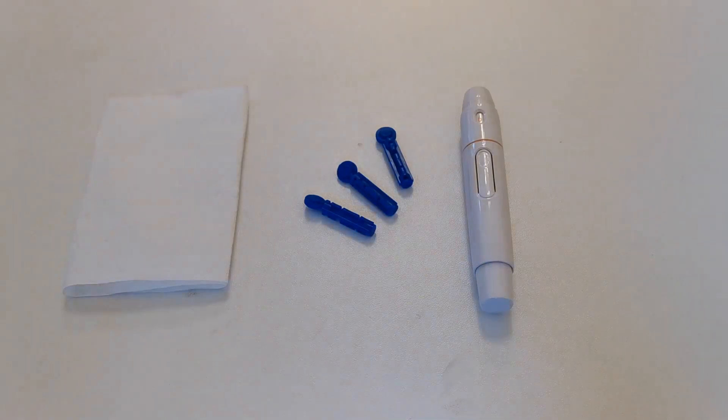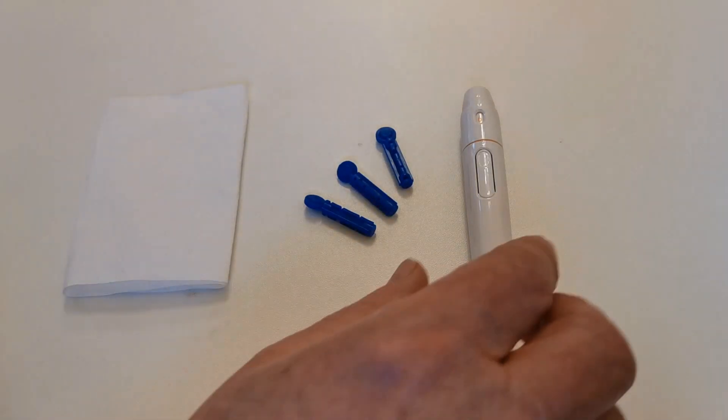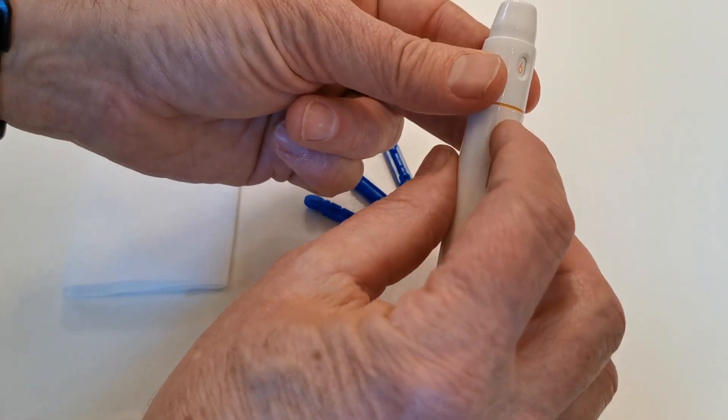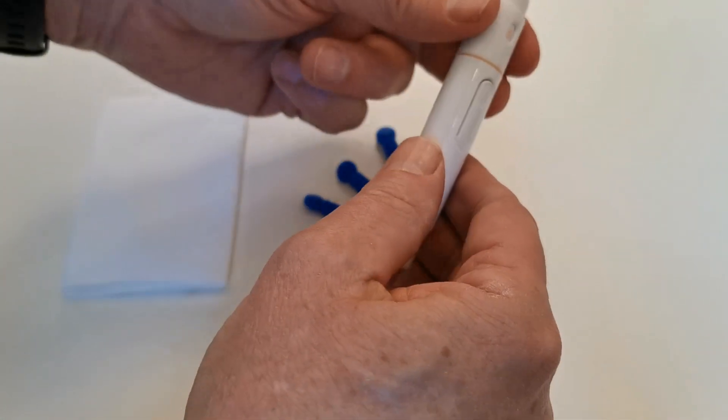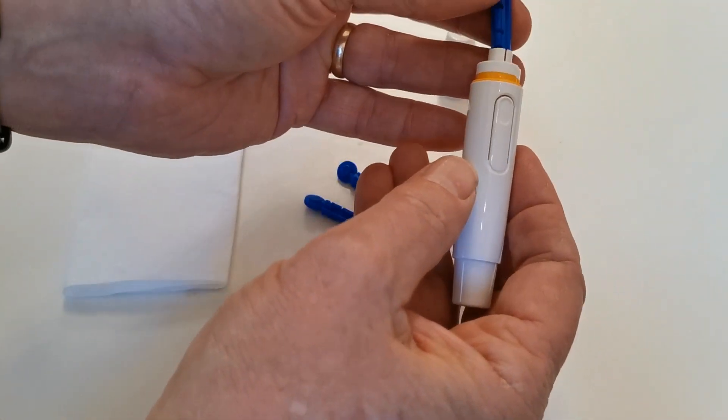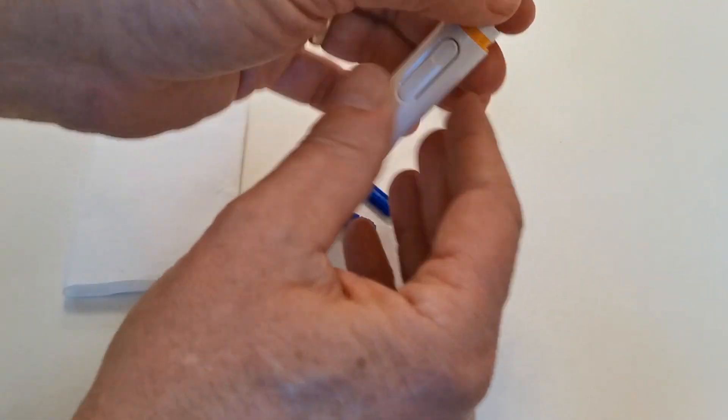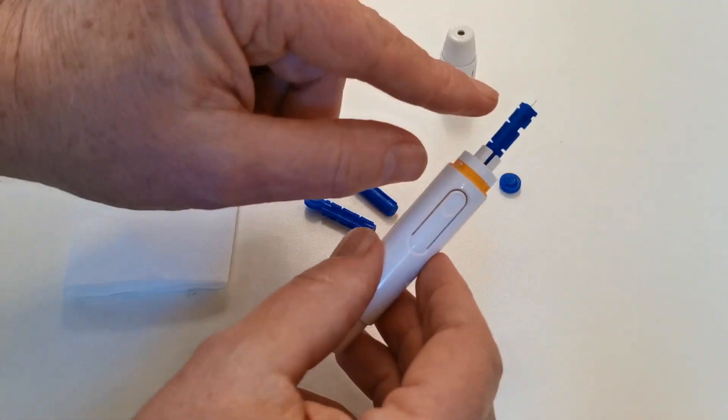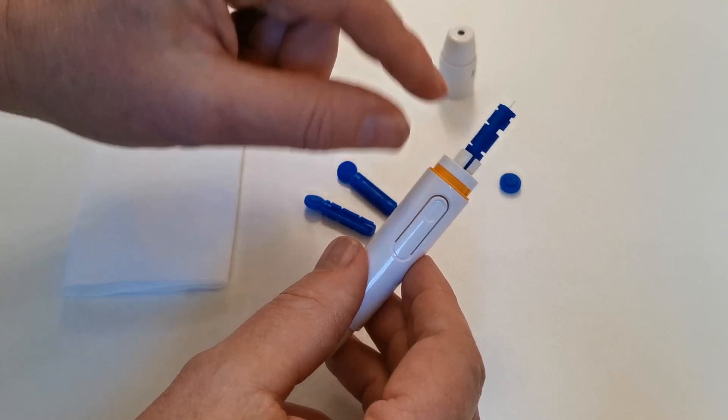In this section we're going to show you how to correctly use one of these auto-lancing devices. They're spring-loaded little devices. Pull back on the spring and release the trigger to fire the lance. When you're ready to do the test, remove the cap and fit one of the lances into the barrel.